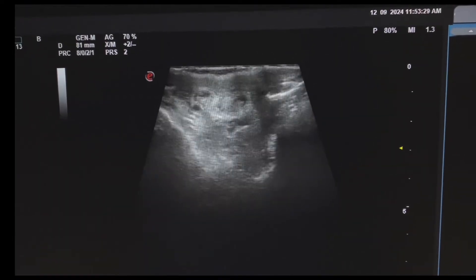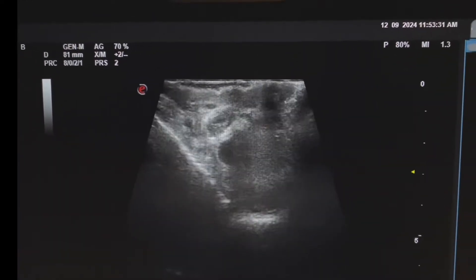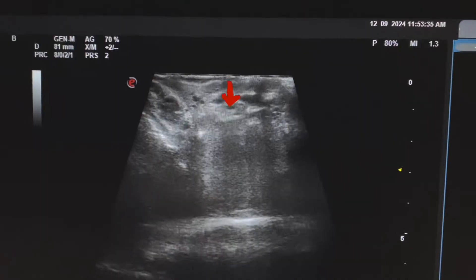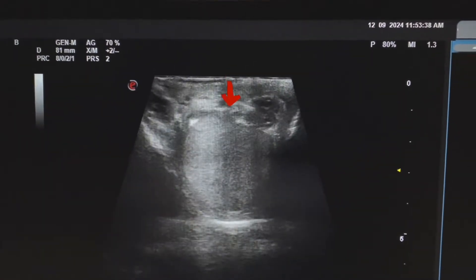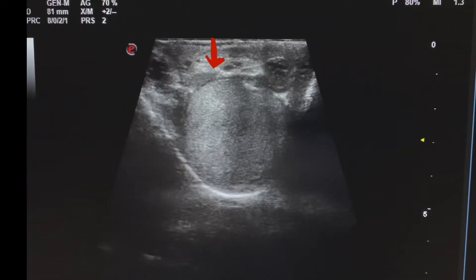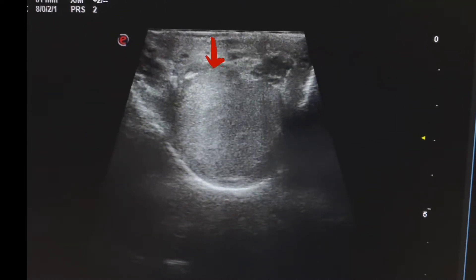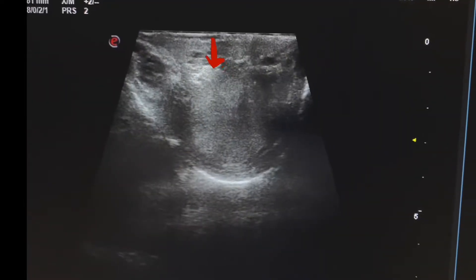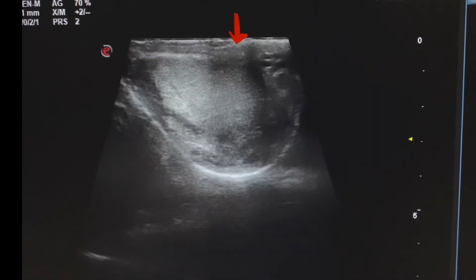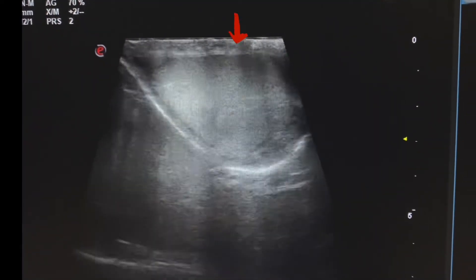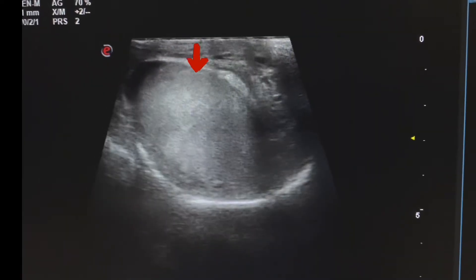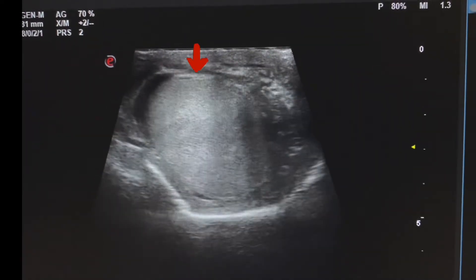Now we start ultrasound of scrotum. This is the left testes, which shows normal homogenous texture. This is the transverse view of the testes, and this is the longitudinal view. The texture of the testes is light gray and granular.